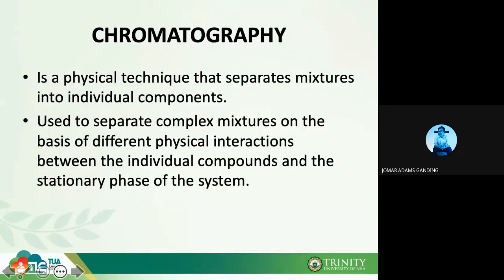So take for example, I have a solution that contains sodium, potassium, and chloride. Or take for example, they have different components like different therapeutic drugs. And I want to measure each one of them, okay? I can perform chromatography. So number one, chromatography separates your mixture. Take for example, you have a homogeneous mixture. You are able to separate each component from the other using chromatography.